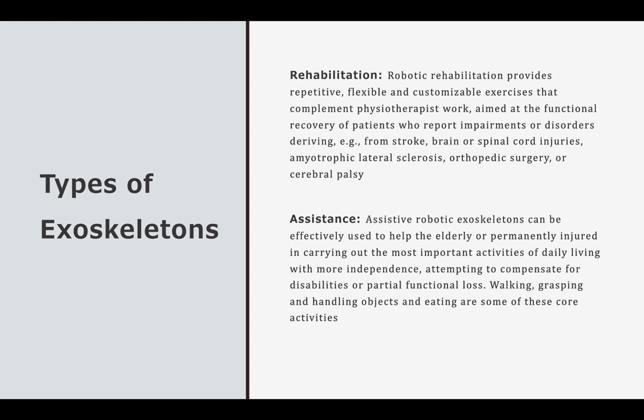Assistive robotic exoskeletons can be effectively used to help the elderly or permanently injured in carrying out the most important activities of daily living with more independence, attempting to compensate for disabilities or partial function loss. Walking, grasping, and handling objects and eating are some of these core activities.